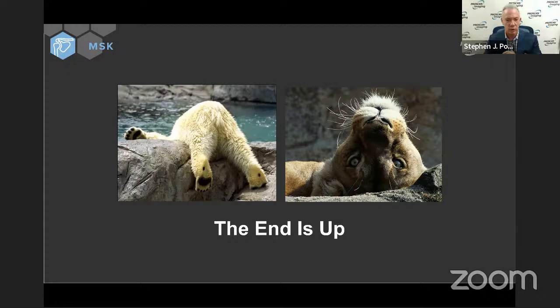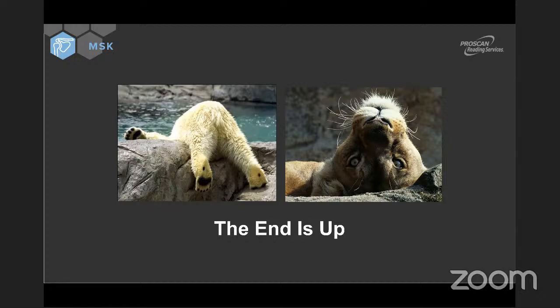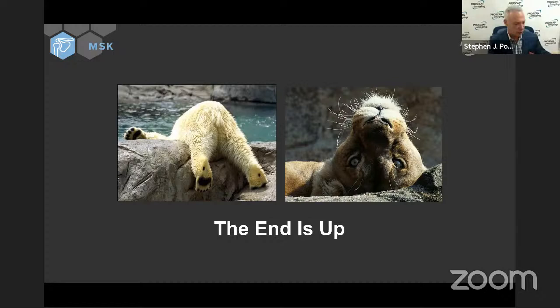Next question. The tear of lateral and long head of triceps, do you call it total triceps tear? That is a very good question. If you tear the lateral head and the long head, do I call that a complete or total triceps tear? I do, because I know in my heart that the medial head just about never tears. So if I lose both those structures and they're retracted, I will call it a full depth, full width tear. And then I will go on to specify involving both the lateral and long heads. Now, in the rare event that I have also torn the medial head, I'll then say separately that the medial head muscular bundle with its short tendon is also disrupted. So I'll leave that as kind of a separate subject. That's just how I do it.